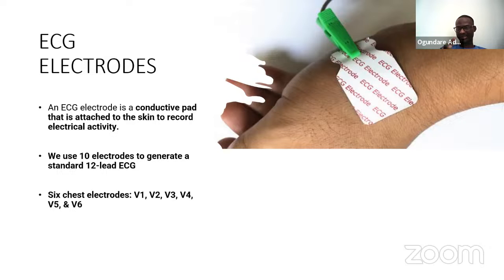But prior to that, there are 2 categories of electrodes as well. We have 6 chest electrodes, consistent with the 6 leads. That's V1, V2, V3, V4, V5, and V6. Those are the 6 chest electrodes. Then we have the limb electrodes. There are 4 limb electrodes. I'm sure we all have just 4 limbs, so it's easier to relate. We have the right arm, left arm, right leg, left leg. So that's RA, LA, RL, LL.